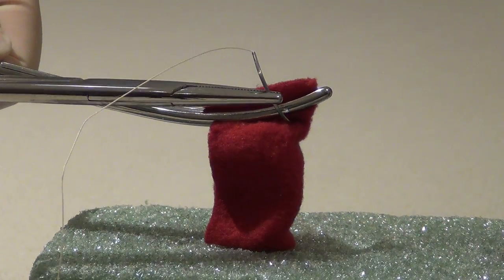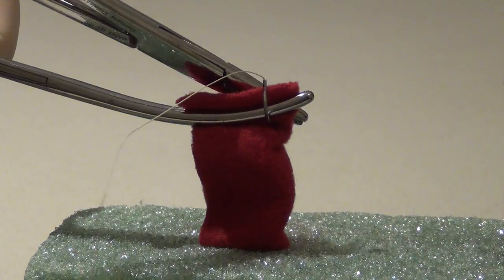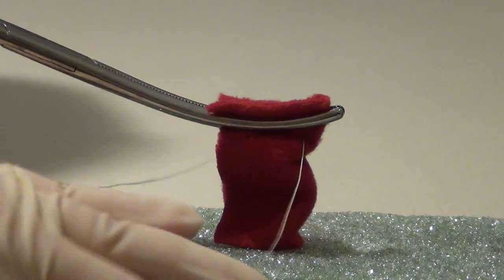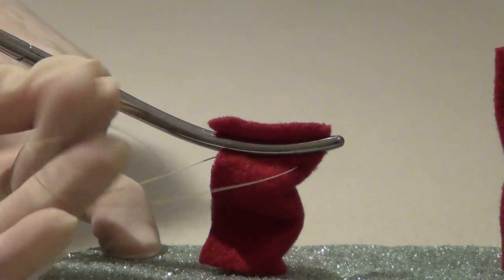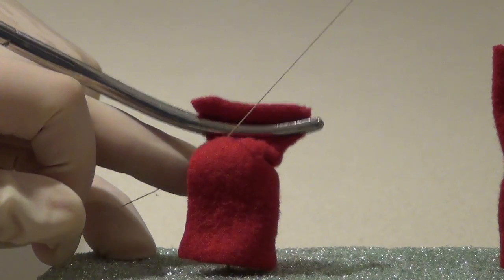For the simple transfixation stitch, the suture is placed at the front of the clamp. It is then removed and the tails are brought around behind the back of the clamp so that the knot can be tied down at the back of the pedicle. Once the knot is tied down, the clamp is removed.